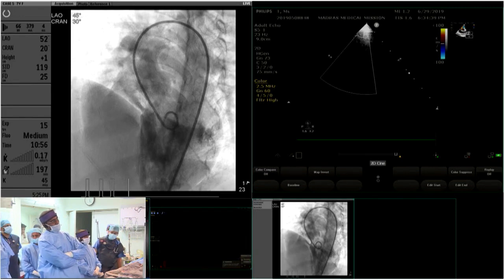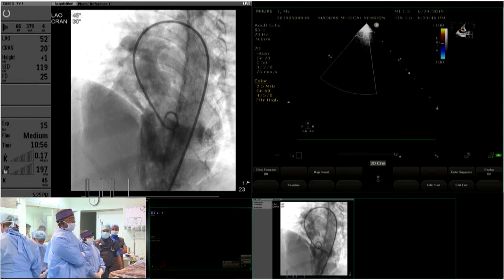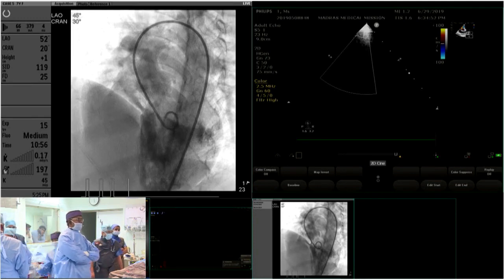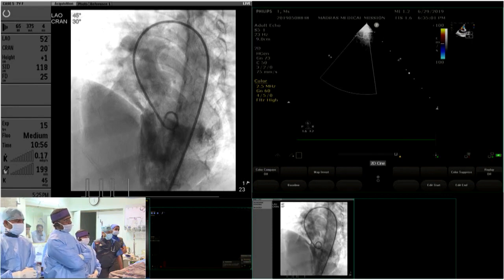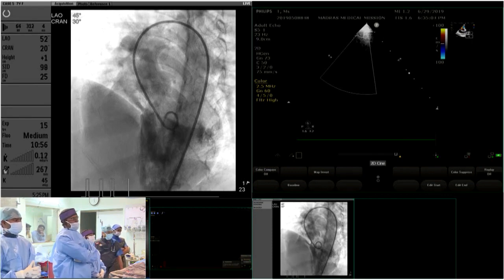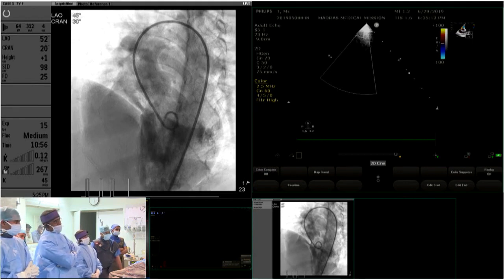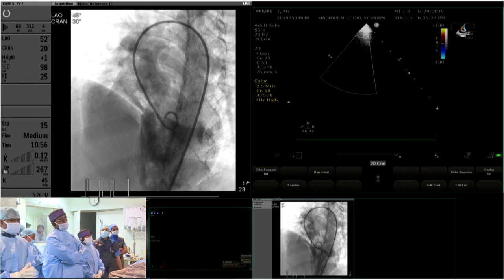However, the other options that are available are, Occlutech has made a new perimembranous VSD device which is much softer and has got a tilt cable mechanism where the cable doesn't hold the device perpendicularly. So after the device gets positioned across the membranous septum, there will not be a tension on the cable which is seen in ADO1 device or in a muscular VSD device. So the options are ADO1, a muscular VSD device, an Occlutech perimembranous VSD device, or something similar to what I used in the previous patient, one of these LePu MemoPAR devices or LifeTech devices.